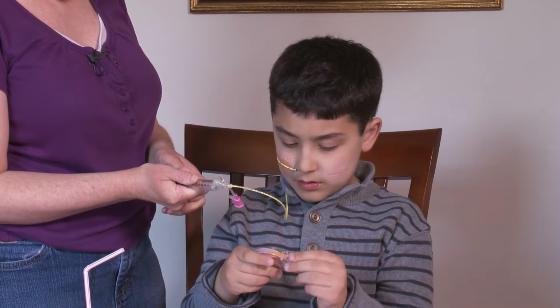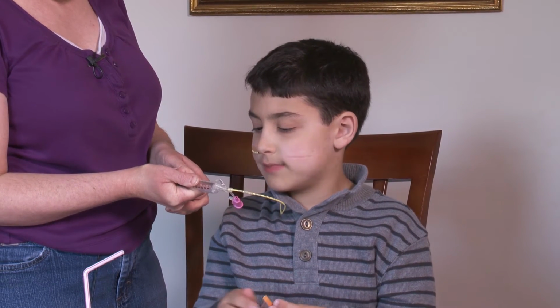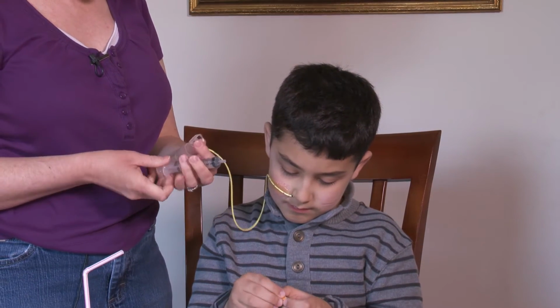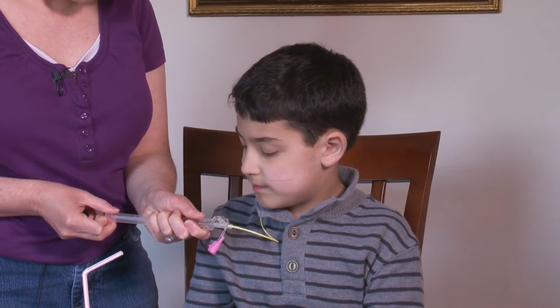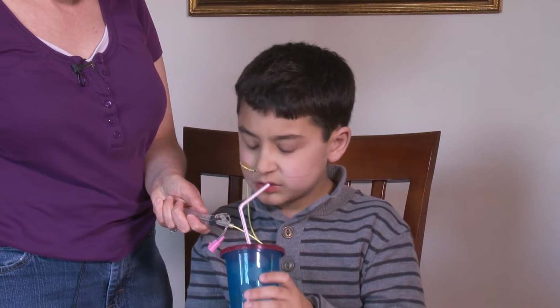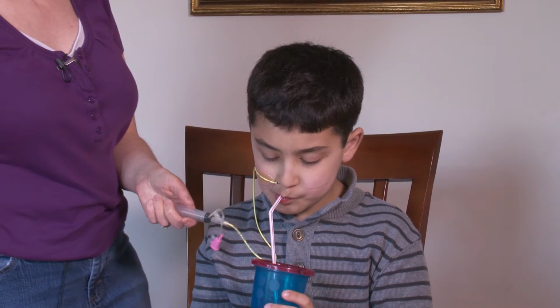Now some people say if you use a 60 cc syringe that you'll have better luck getting stomach contents. Yeah, a little. I think that's just what was in the tube. Sorry. Mostly you just get water. Uh-huh. Here, drink some water, bud. No, actually, like, drink some water. There's probably not much in your stomach.